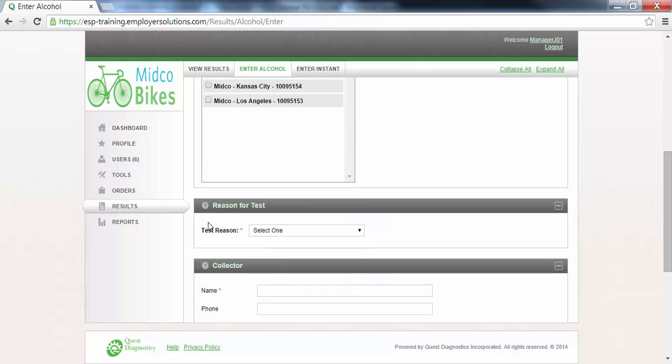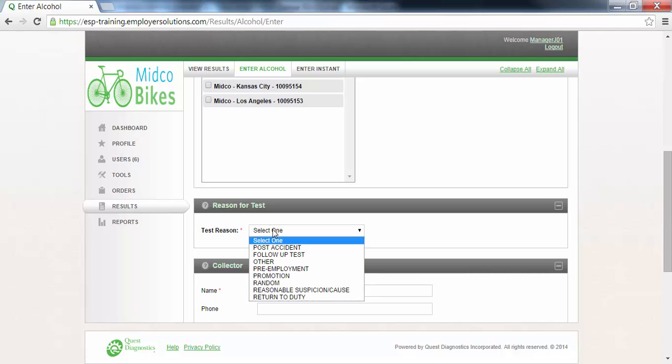The reason for test section is where you will select the test reason for this donor from the drop-down list. In this example we will use post-accident.